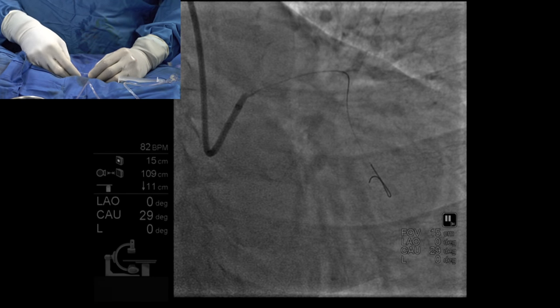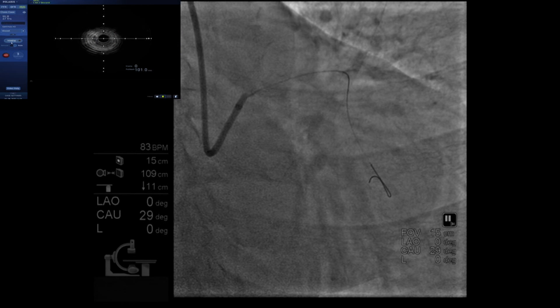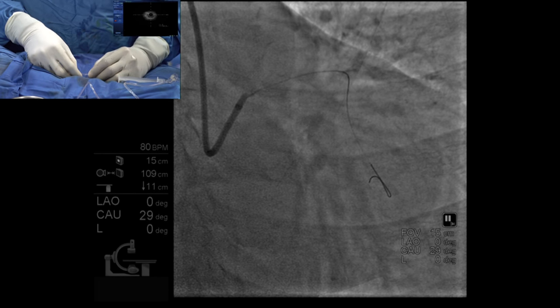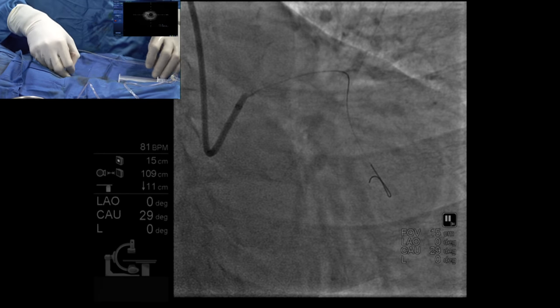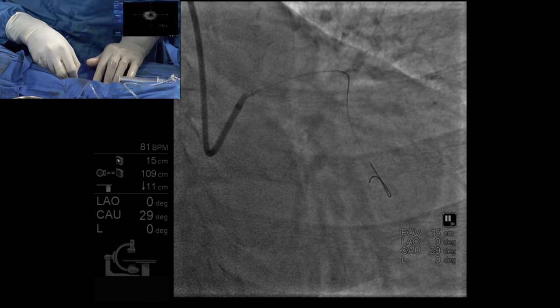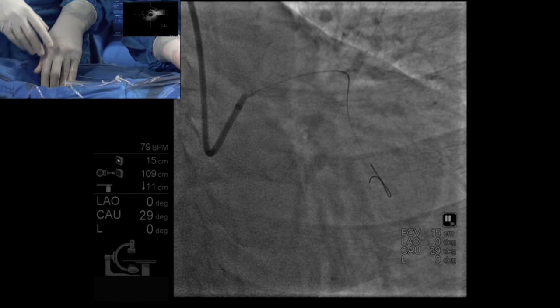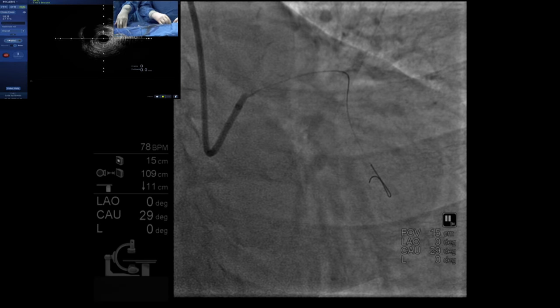If a wire's not working for you, I don't go from 3 to 6 to 9 to 12. That takes hours. You don't have hours to do these procedures. I go from a 1-gram wire to a 12-gram wire. I make a big change when I make a change. As a CTO operator, you need to understand how these wires are built and what they're designed to do, so that you can translate that into practice and use wires in situations where they're designed to perform.